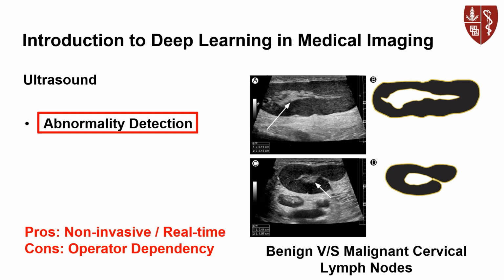You can see that if I take the region of interest over here and extract it out, right? So this is the entire region of interest, right? And on the other hand, in scan C over here, I can take out this complete region of interest over here, right? And this becomes a group of pixels, right? And it only makes sense to implement an image segmentation model over here to segment out the areas of interest and try to classify whether it's benign or malignant, right?